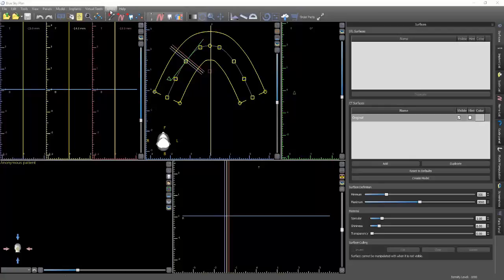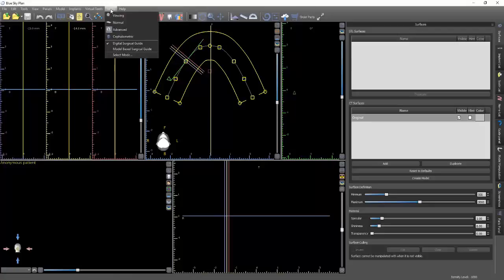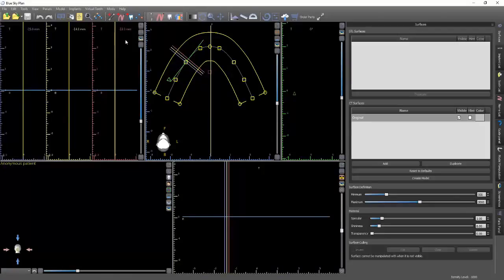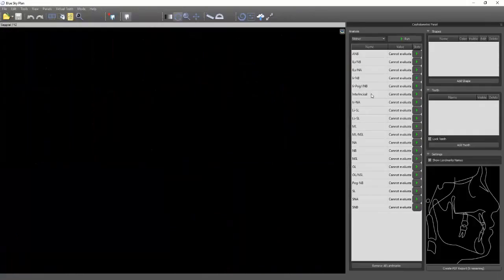So first of all, we're going to come up here, go up to Mode, and we're going to make sure the cephalometric mode is enabled. You'll see that the whole display changes — your tools up top, everything.